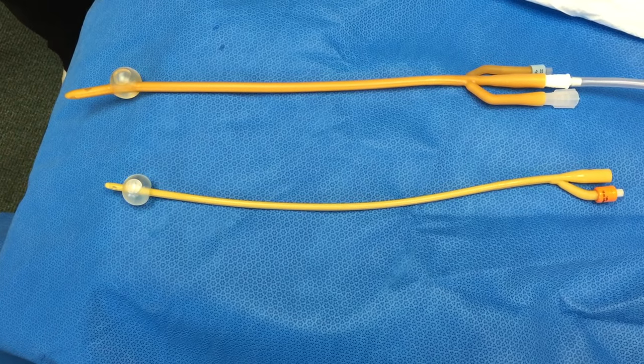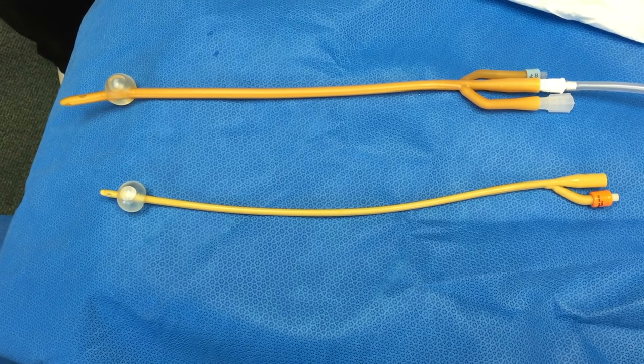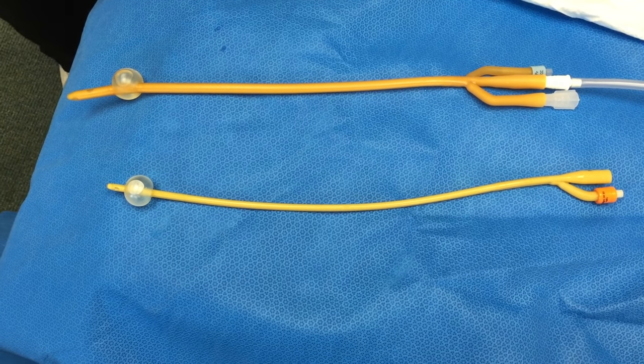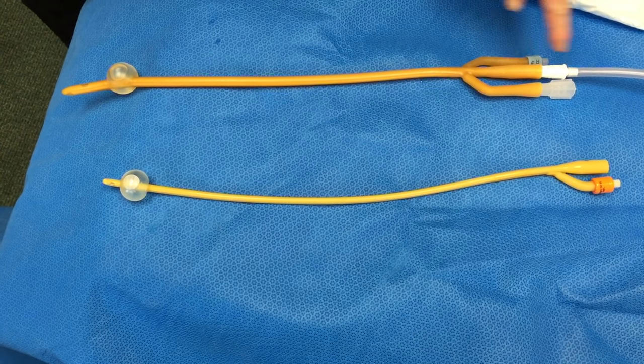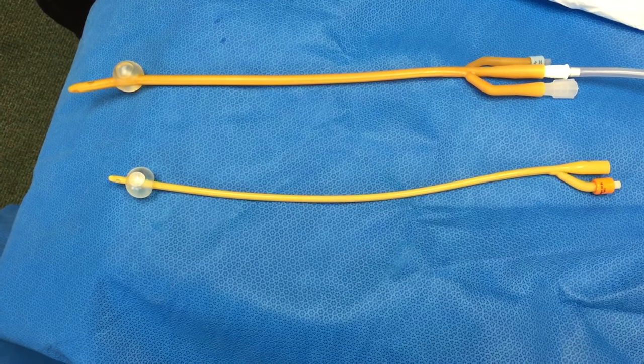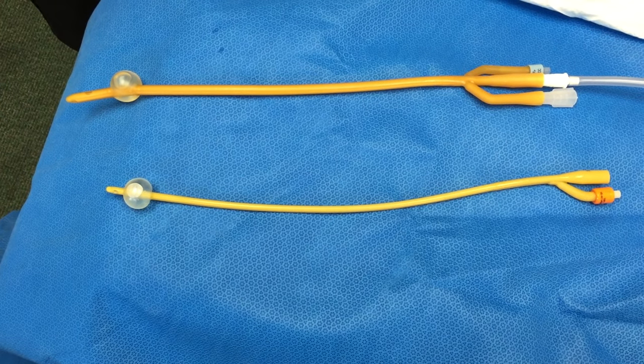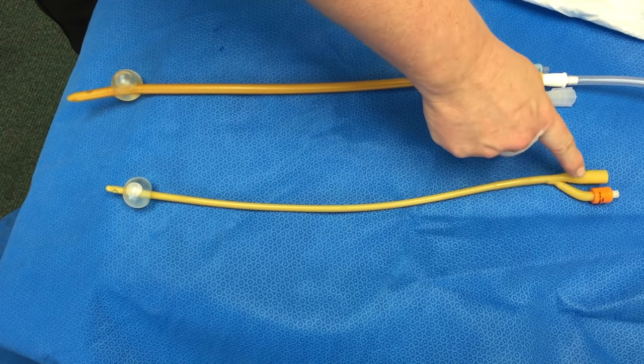In order to remove the catheter, this balloon must be deflated. This may be done by identifying the balloon port on the Foley catheter. There are several different kinds of catheters, but all catheters have a balloon port, which is easily identified as the short port that has a colorful plastic tip.